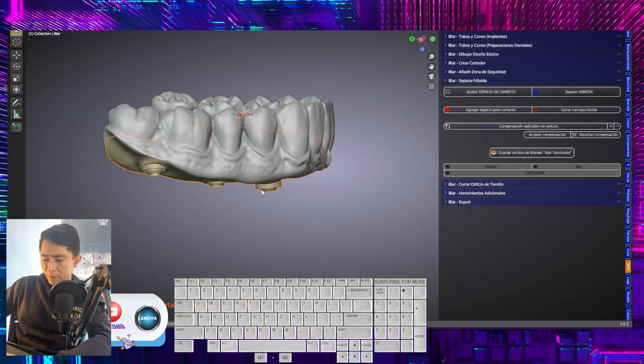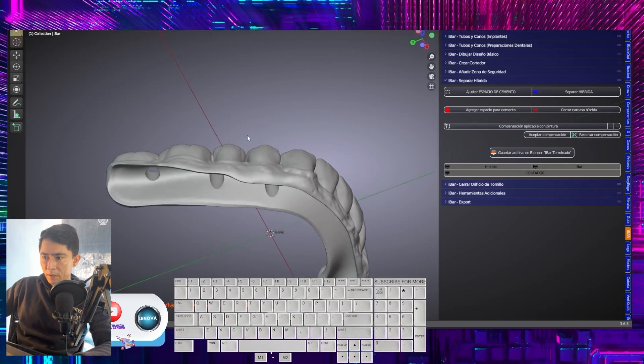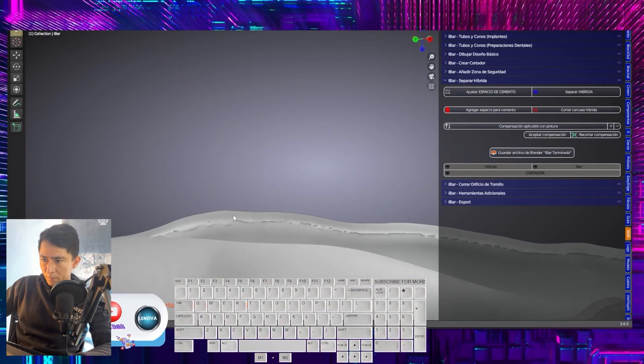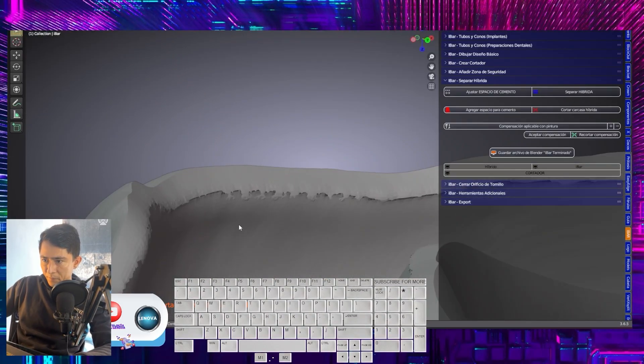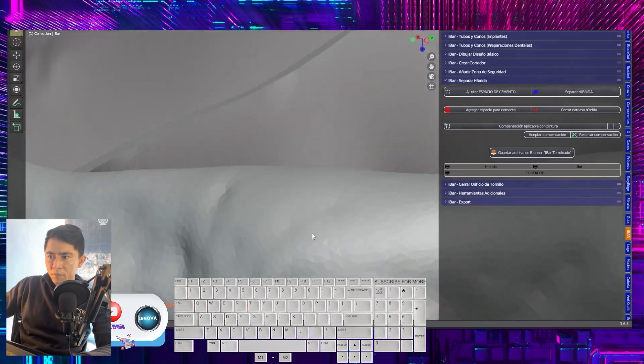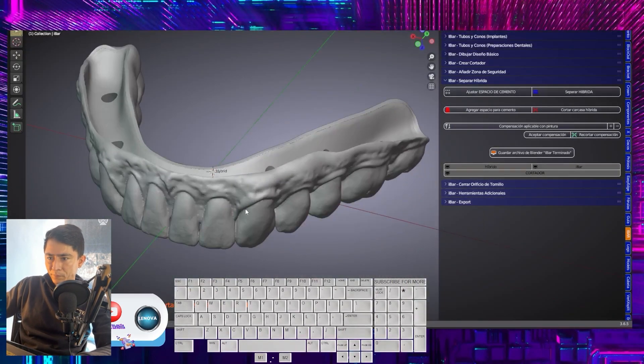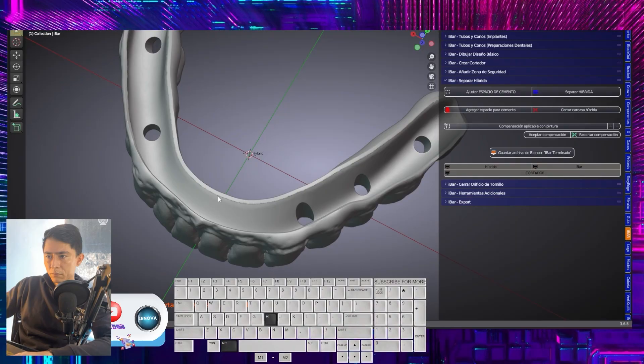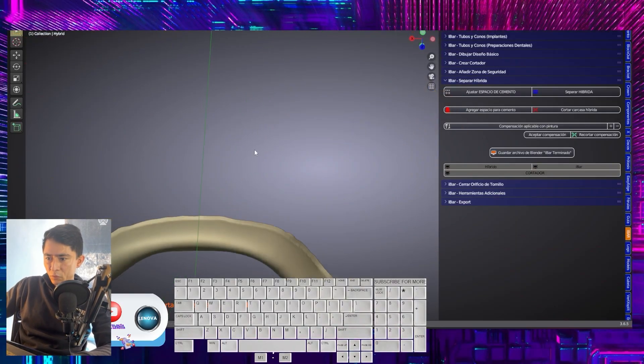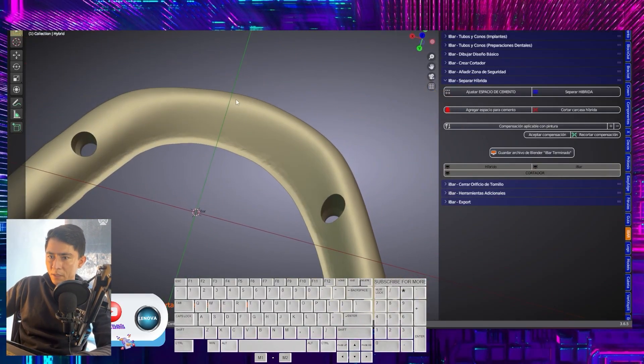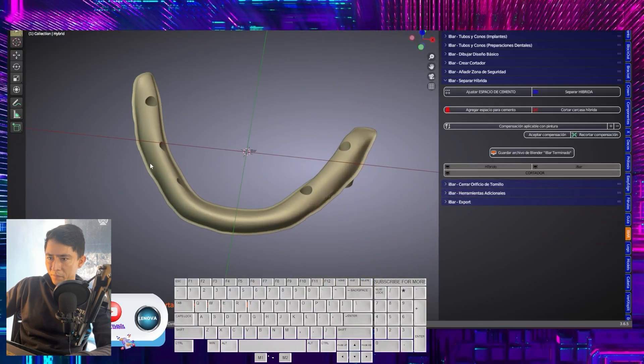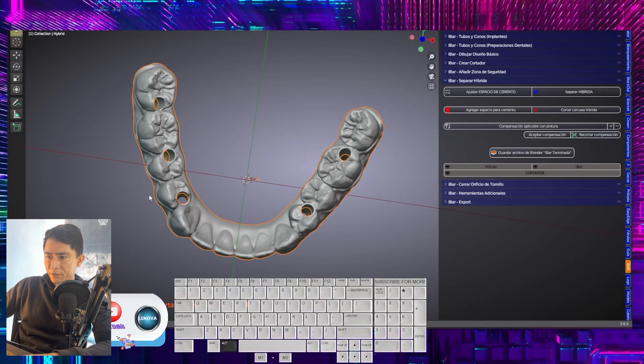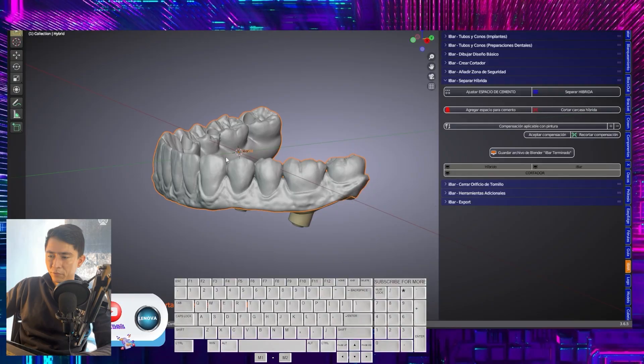I'm going to hide the bar first. Look how it turned out. Now let's go. With our bar, we hide the Supra. And that's how it turns out. H to visualize all the elements. So this is the flow we use for designing the hybrid bars.